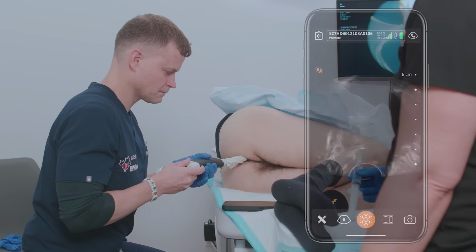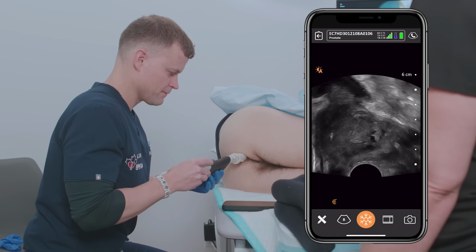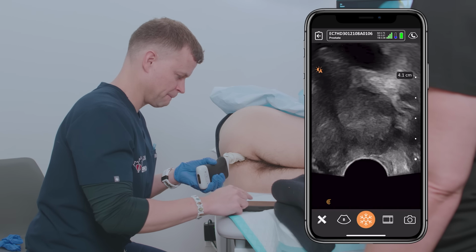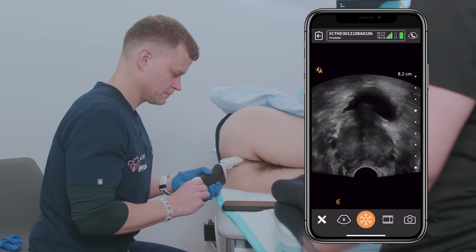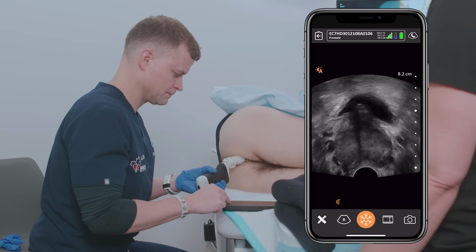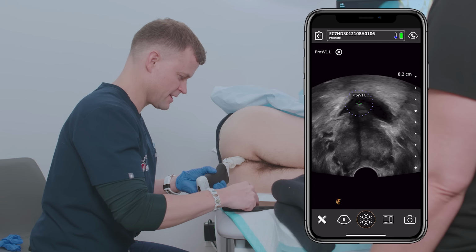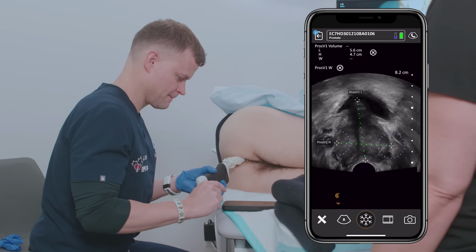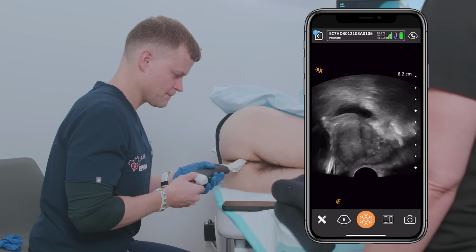We begin the procedure with the safe and careful introduction of the EC7 probe into the rectal fossa. At this point, we will start by measuring the three dimensions of the prostate. So careful assessment of the periprostatic structures, the very large veins that could be seen in the periphery, and determining clearly the capsular dimensions, the width and height of the prostate, quickly saved to the cloud, followed by the sagittal view.